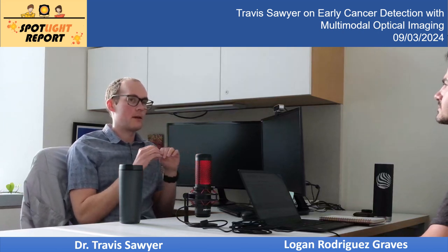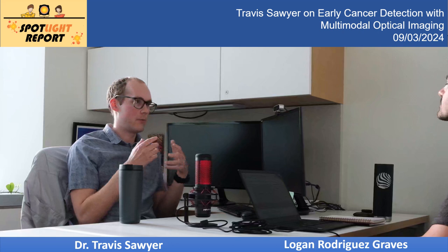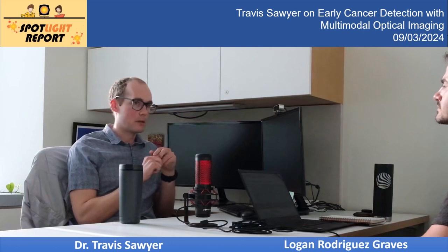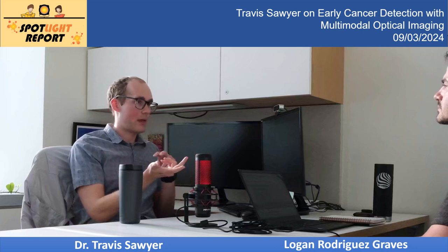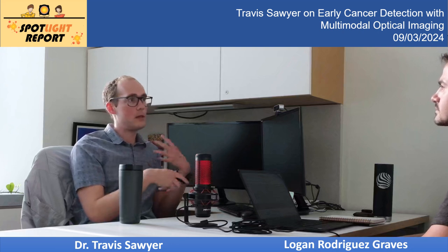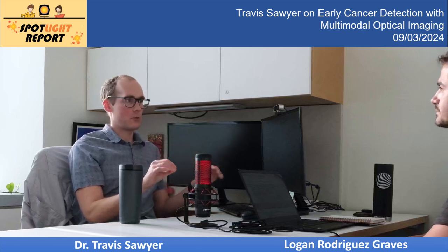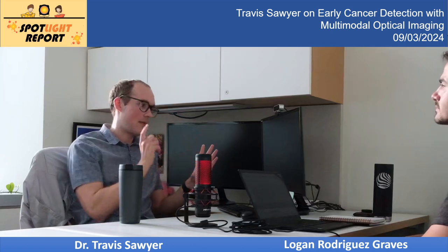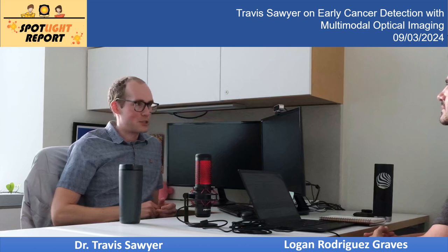So folate is a biochemical. I can't remember its role in the body, but it's very relevant for the reproductive system. And so we wanted to look at that for the ovarian cancer specifically because I believe the amount of folate goes down when you have cancer. And so the idea here was we bound that to some antibody. You would apply that to your patient. Usually it's done through an IV, could be topical. And then in this case, you could do a wide field of view. And so this could be an approach where you do a large area screening. You might see an area light up with this fluorescence, and then you go in with OCT or multi-photon to get a really high resolution confirmation.